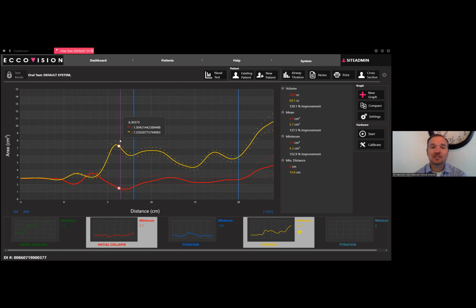In this day and age, it's so difficult to get a CPAP machine, and it's so prolonged to get into a PSG, an in-lab sleep study, that he's advocating, I think, anytime a dentist has identified this, they should go forward with an oral appliance, retest if they're moderate or severe. And if it's being managed, you're done. And if they're not, then you at least got something in the interim between when the problem was discovered and when it's maybe going to end up properly being managed down the road with what they need.